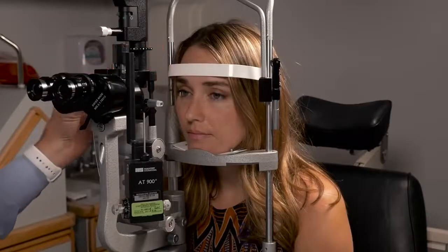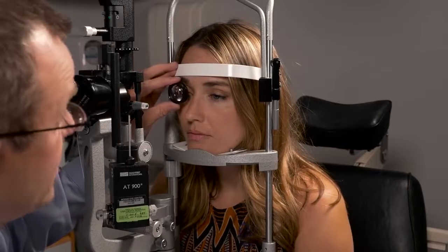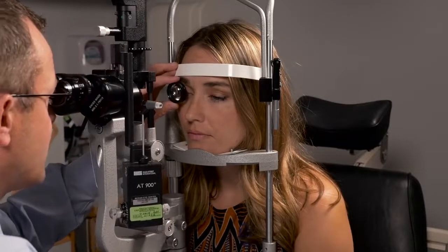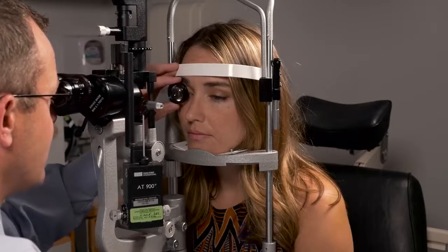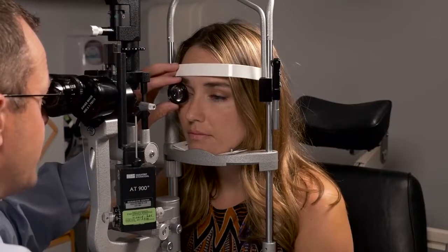As a general rule, you're going to hold the lens with two fingers, your pointer finger and your thumb, and then you're going to use your pinky and a lot of times your ring finger either resting on the patient's forehead or on the forehead rest itself, the plastic forehead rest. And then the trick of how to do this is you're going to put it up in front of their eye without touching it, but just in front of where their eyebrow is. And then you'll look in through the slit lamp, and once you find their pupil, you're going to pull back a little bit till you see the orange beam come in focus, okay?